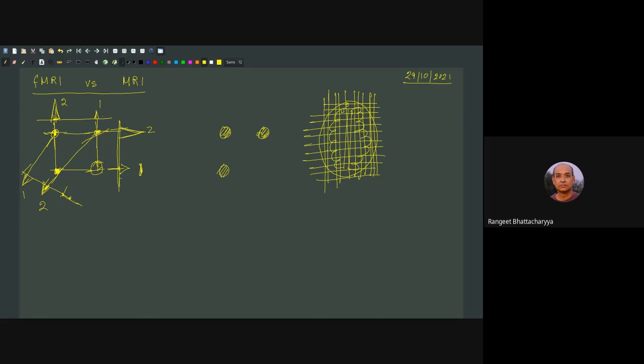And then for each part of the grid, you can focus and check whether you're supposed to get any signal. It could be part of the skull, or it could be something which does not have much proton concentration, in which case you don't get a signal. So there would be some dark regions, there would be some white regions. Assuming that your proton density is more or less constant, you find protons or not find protons, and that will eventually give you an image like what I drew initially. So each grid point plays the role of one small pocket.